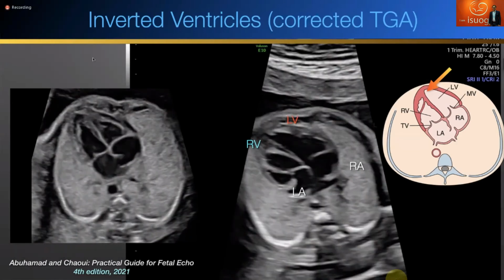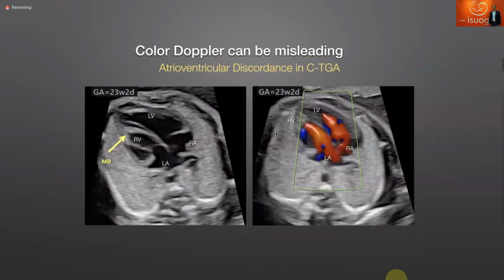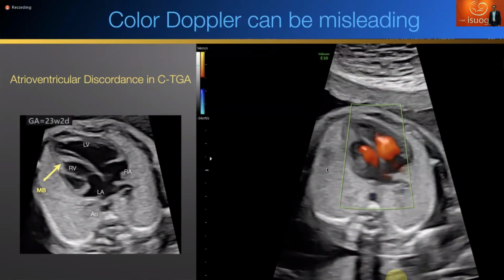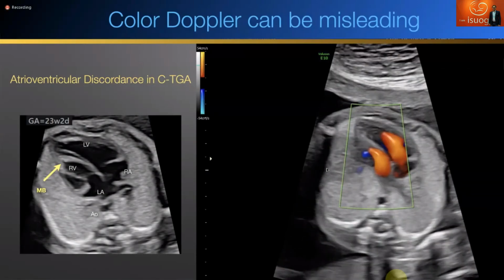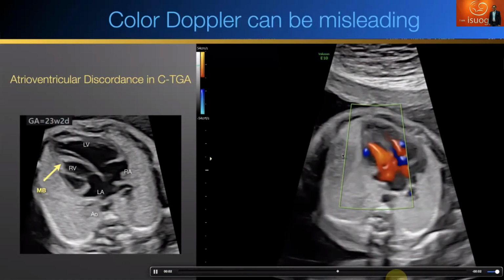And imagine if you don't magnify, zero chance. Now, if you are adding color Doppler, you will not see it. And this is why I put the color Doppler in the previous one, to disturb you. And you see here, this is clearly seen, but with color Doppler you don't see anything because you say, well, the filling is nice and so on. Occasionally they may have this, but may have a nice four chamber view and you don't notice. The expert could tell you, of course, there is an abnormal color here because this is right ventricular anatomy, and so on and so on.